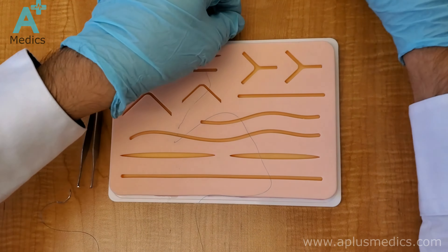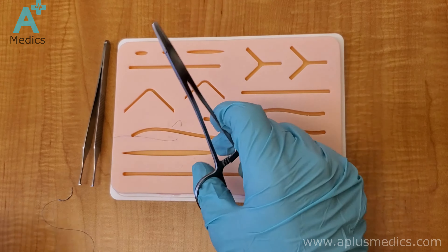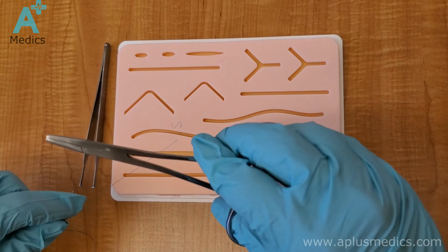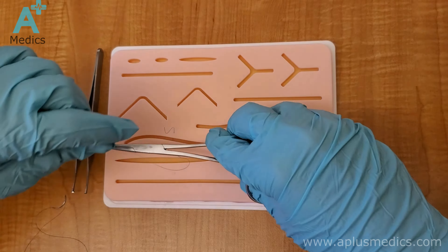The shorter the better, because it makes it easier when it comes to tying the knot. Keep pulling until you have a shorter tail. Now you always start by putting your instrument — your needle driver — directly parallel to the actual cut itself.